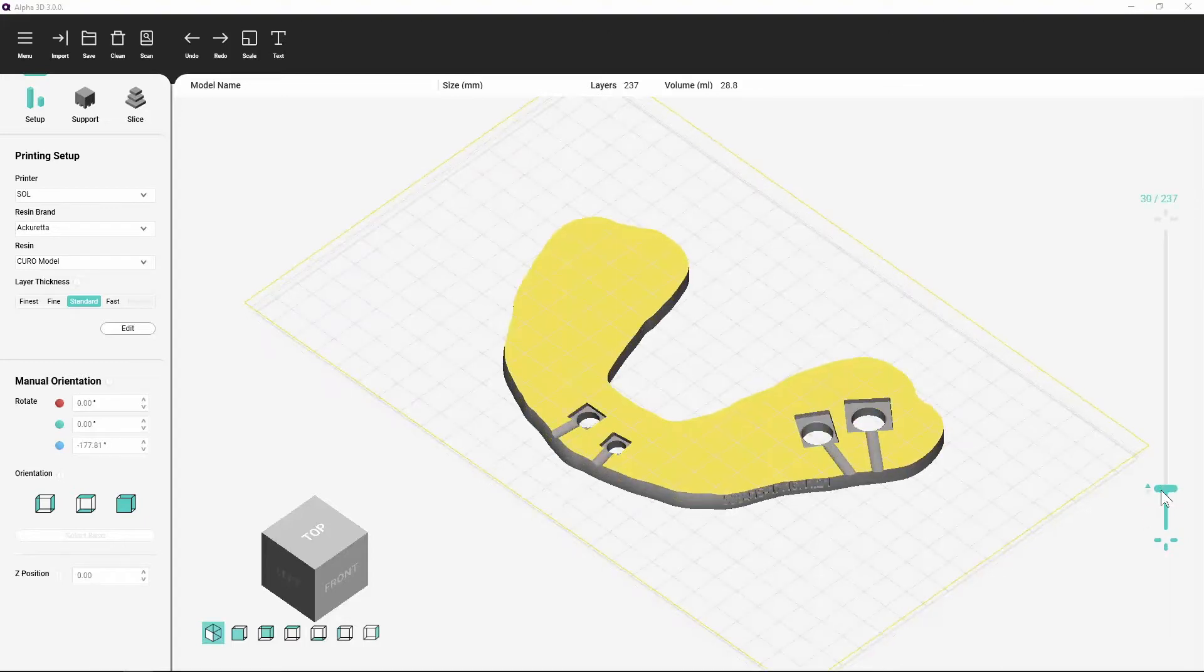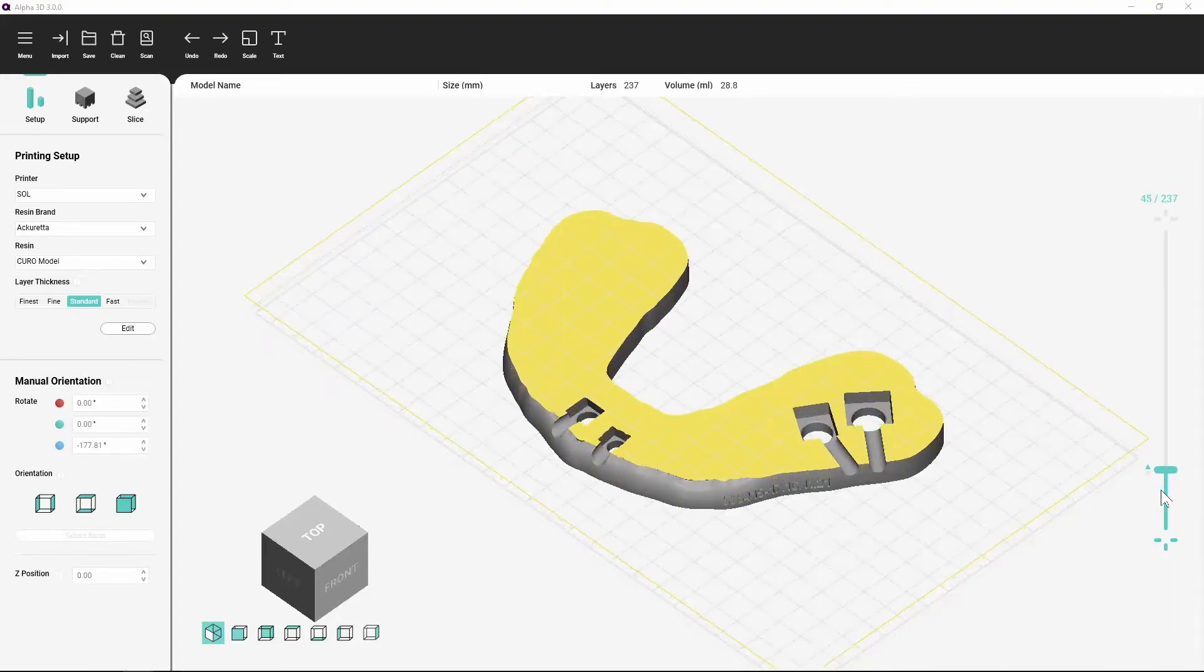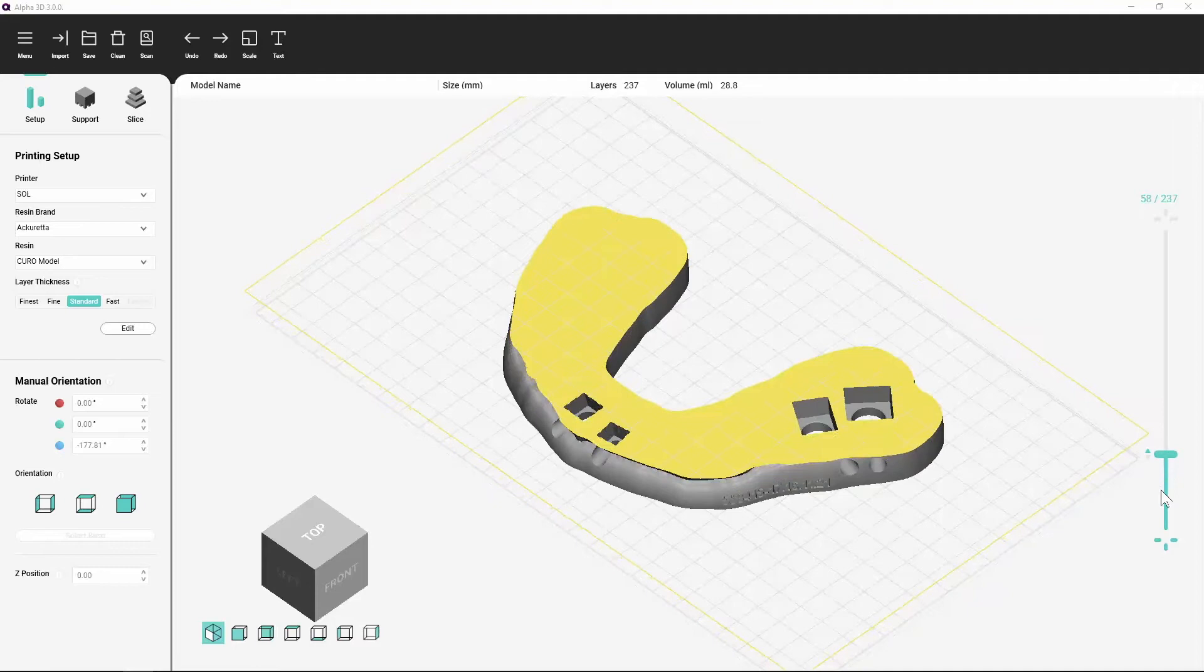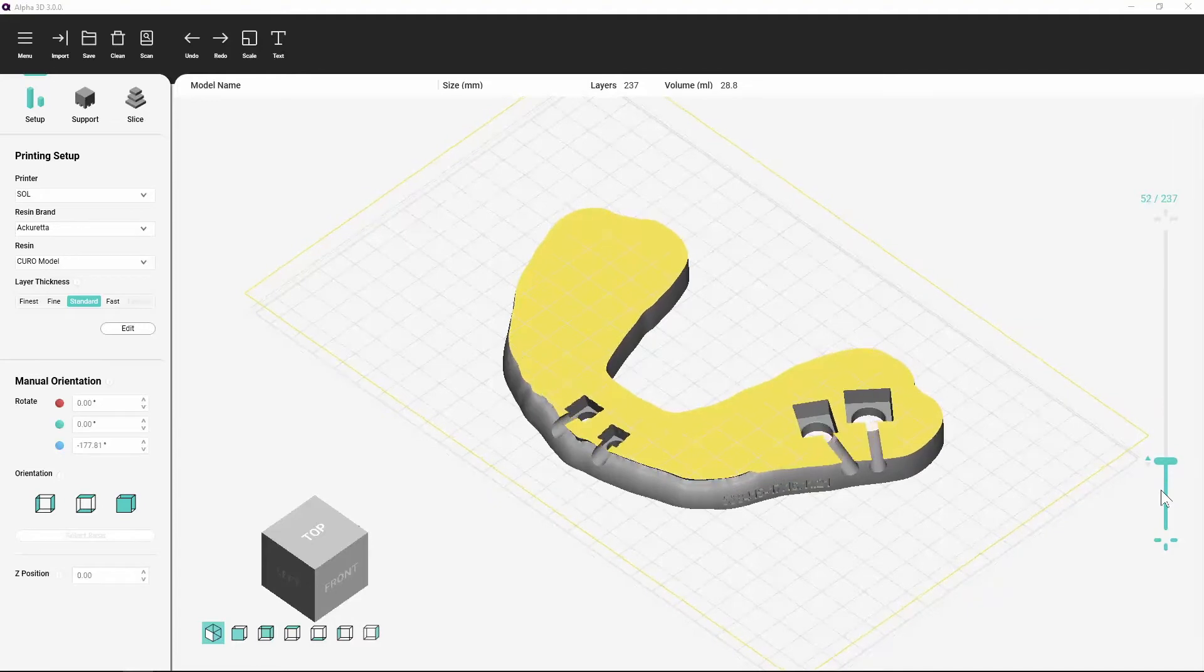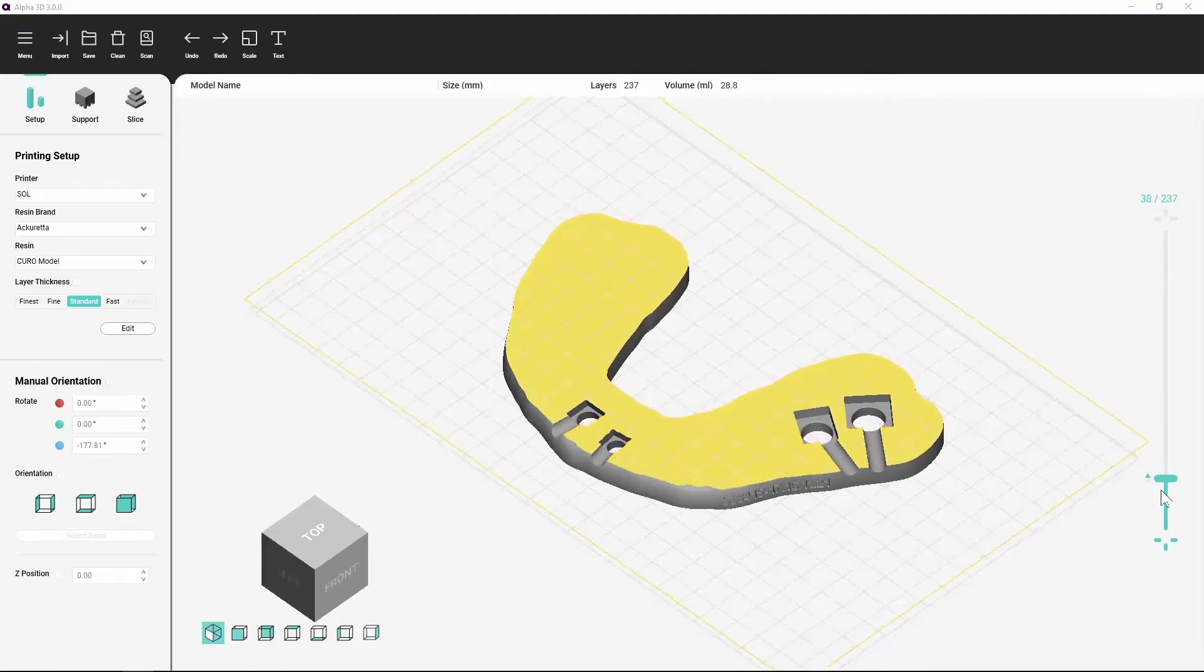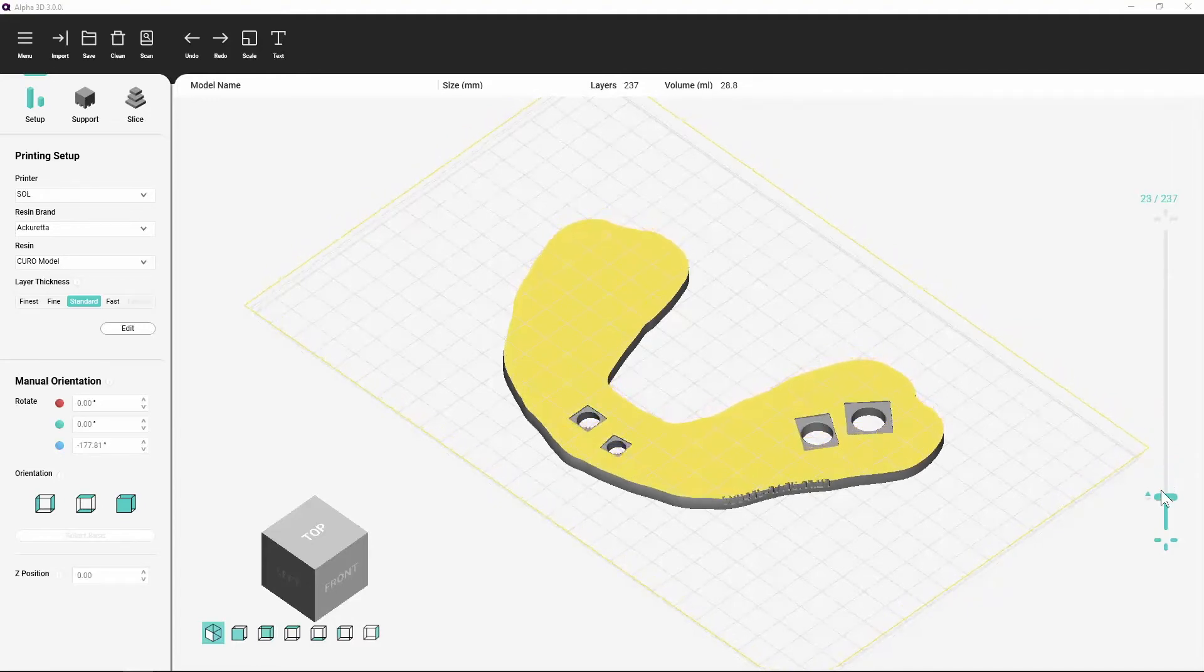You can also press the up and down arrow keys on your keyboard to move the view slider one slice at a time.